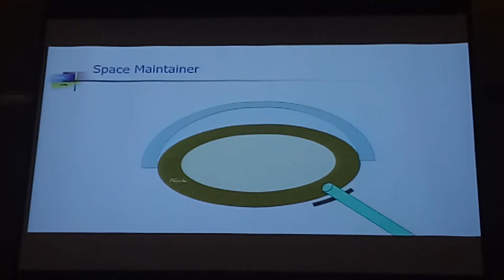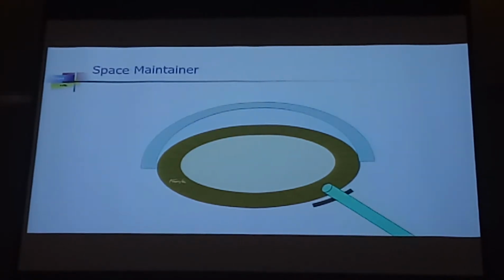So how do we use it in surgery? Mainly as a space maintainer. Now how do you inject OVD? I would suggest that once you go in, inject some sub-incisional above the iris. The reason is you want to depress the iris so that the OVD, when you inject in the center, doesn't creep underneath the iris. If it creeps underneath the iris, it makes the surgery very difficult because the iris will bow forward and then has a tendency to prolapse through the wound.